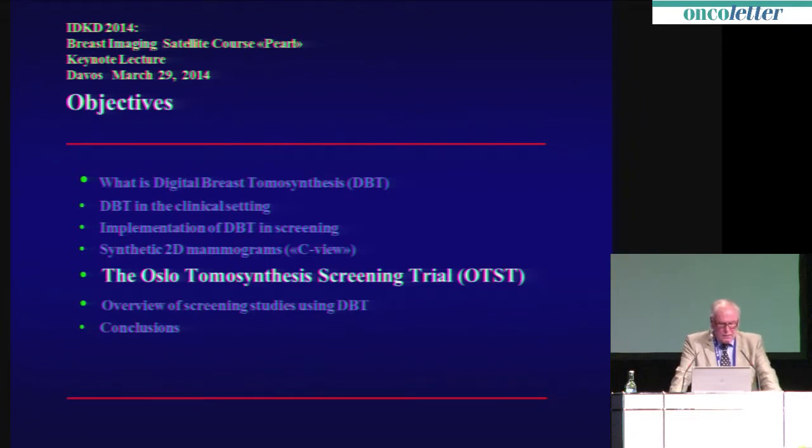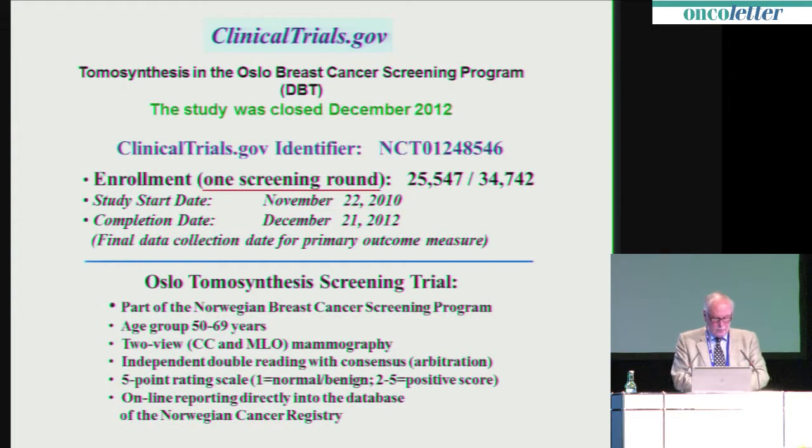Okay, so that means that it should be possible to implement tomo in a screening setting with the same radiation dose that we have for conventional 2D images. And that was the background for our Oslo tomosynthesis screening trial. It is not so easy to understand these trials, and since we have 3 publications so far and there will come more publications, I want to go through this study design with you.